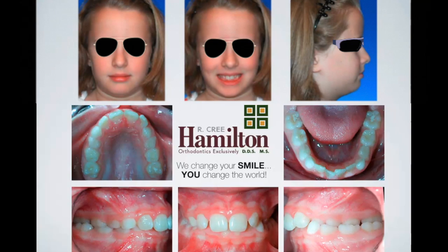Oh, where's my mouse, it's being crazy. Yeah, it's 2 to 3 millimeters off to her left side, correct? Let's see. There it is. Right there. Here we go. So you can see the lower dental midline is about 2 to 3 millimeters off to her left side, right? You also see that the crossbite is more complete on the left side than the right side, right?